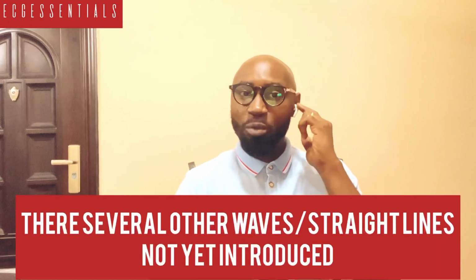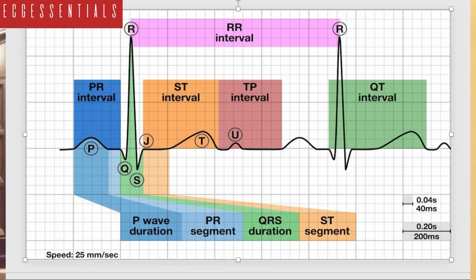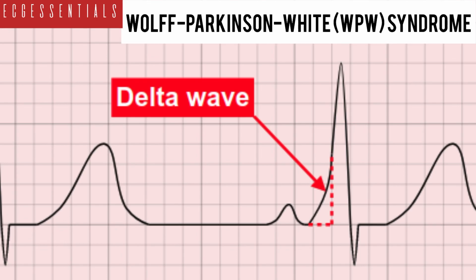I must humbly say at this point that these waves and straight lines that we have discussed so far are just the common ones that we mostly come across, and that we mostly may require to make diagnosis. However, there are several others that we haven't introduced yet. We talked about the J wave or the Osborne wave. We have the U wave, which is a positive deflection after the T wave, and we talk about the U wave in conditions like hypokalemia. We have the epsilon wave, the delta wave, which may be talked about in conditions like Wolff-Parkinson-White. So all I'm trying to say is that apart from these various waves that we have seen now, there are others we rely on to enhance diagnosis.